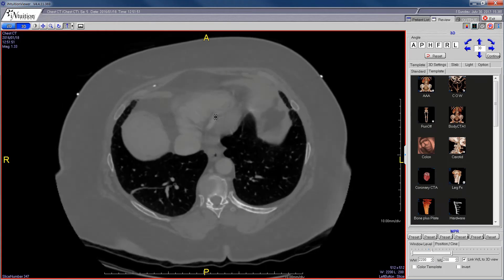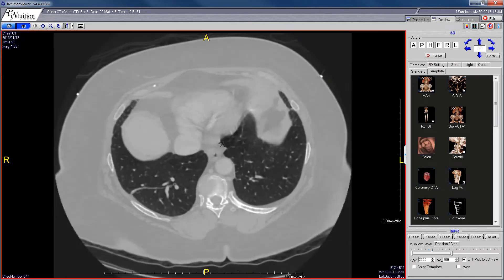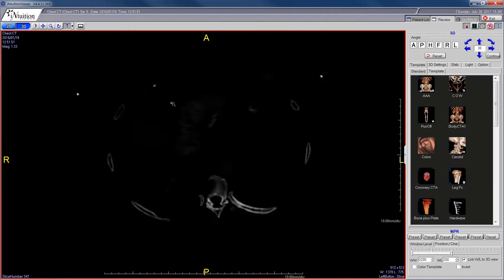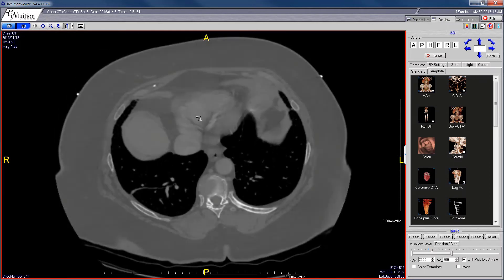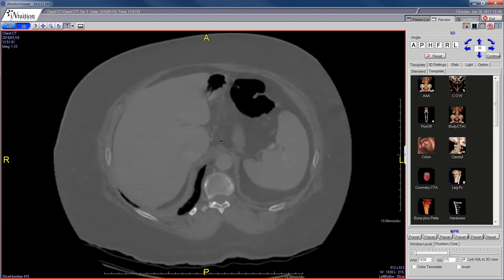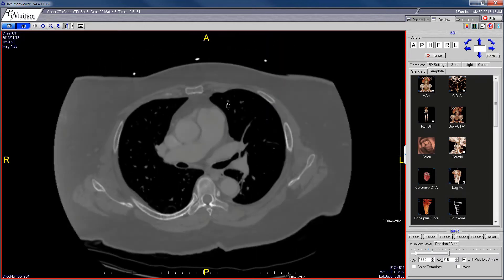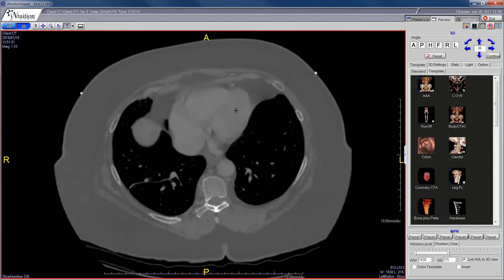If you want to window without right-clicking, you can hold both the right and left mouse buttons down at the same time while dragging, and that will let you window. Once you find what you want, you're back to being able to move with slice up and down.